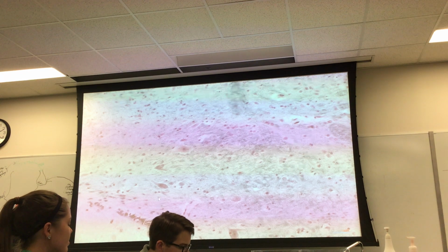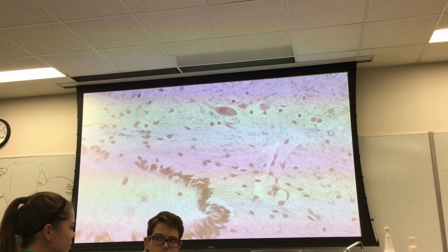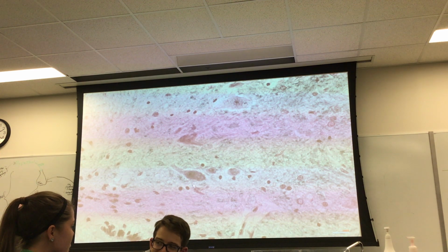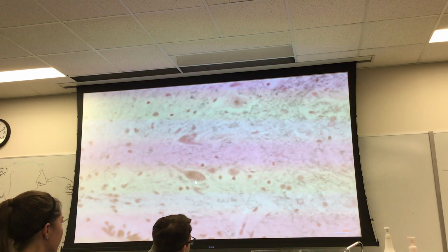So having said all of that, if we now come in here, we increase our mag right about this vicinity, and I didn't change the slide, so if we look around a little bit, what is the name of that cell right here? I'll give you a hint, it's a neuron. So what kind of a neuron is it?